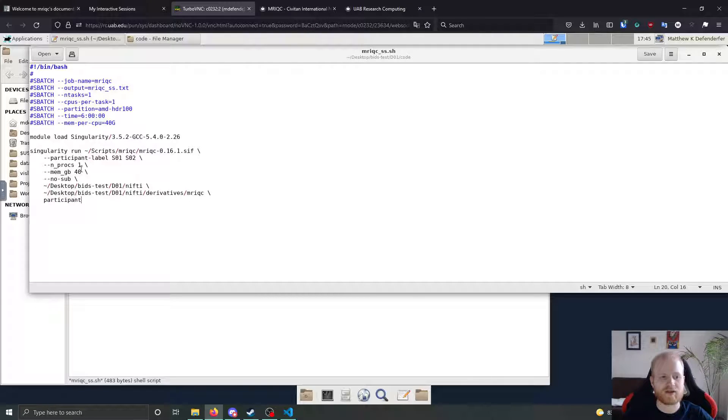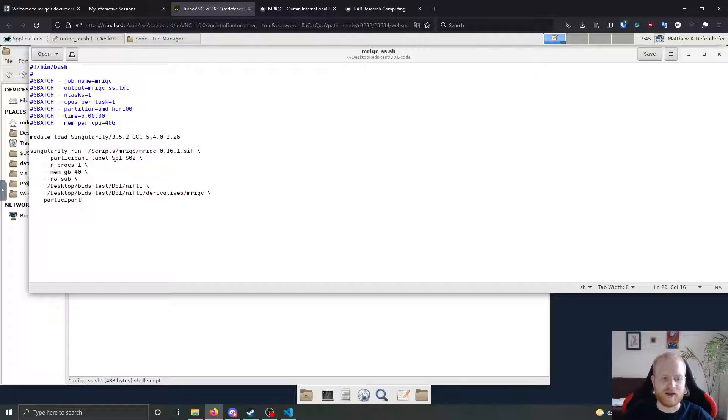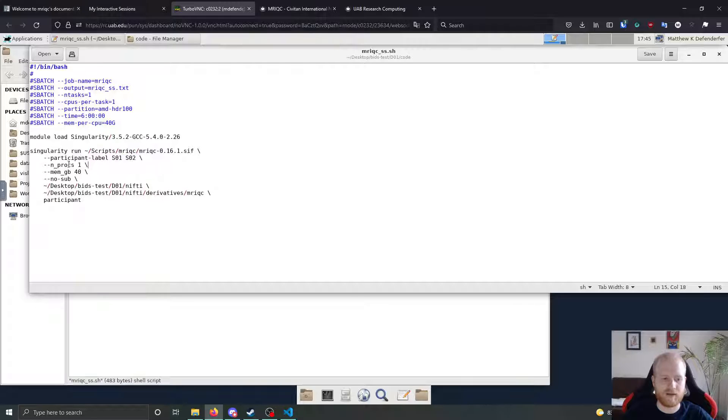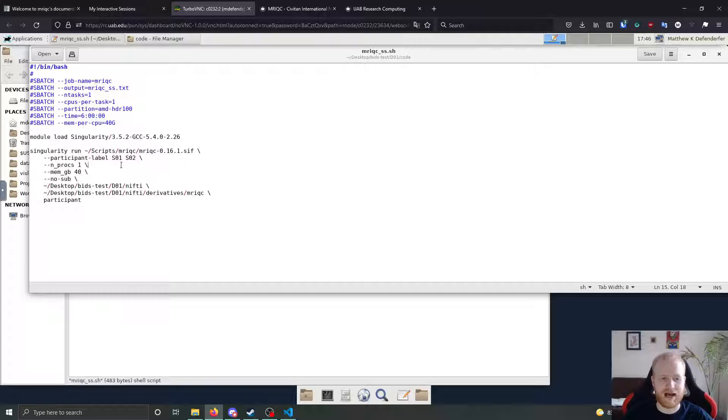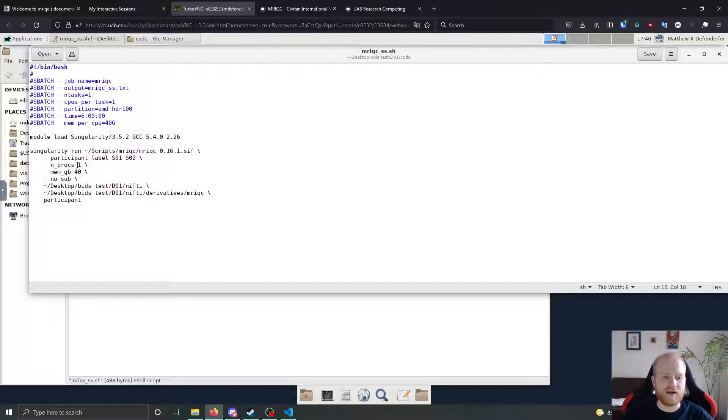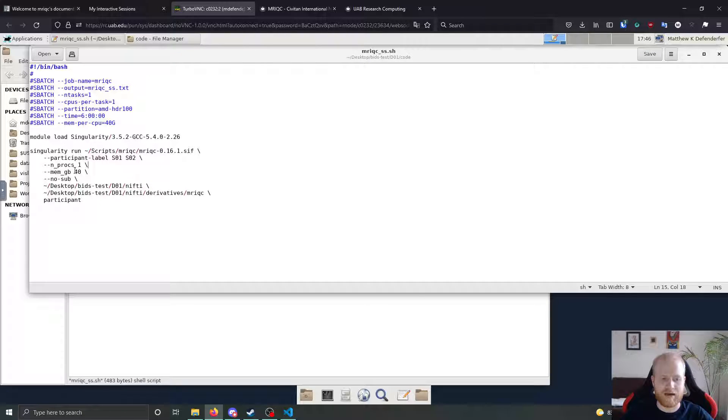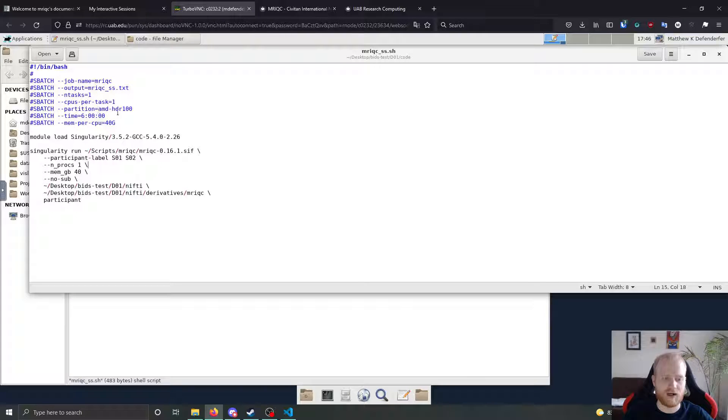So since we're doing it at a participant level, I'm going to give it a list of participants that we actually want to run it on. In our case, the participant levels are going to be s01 and s02, just two participants that I have laying around that I want to run this on. And then I'm giving it the number of CPUs and the amount of memory that I've requested for the job up here.